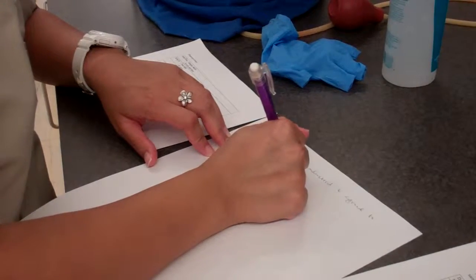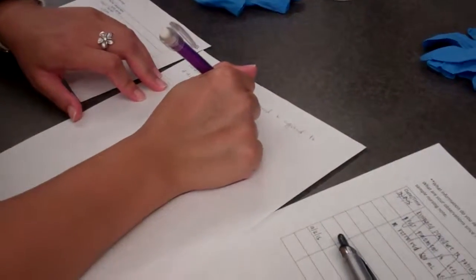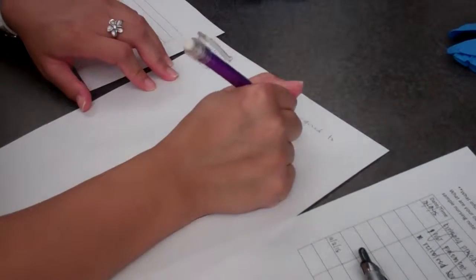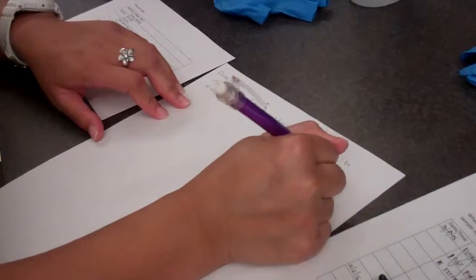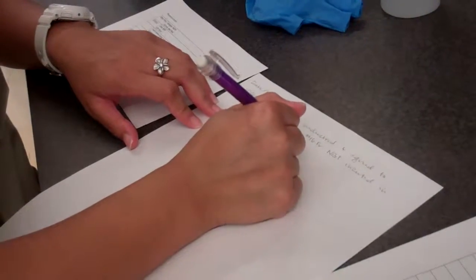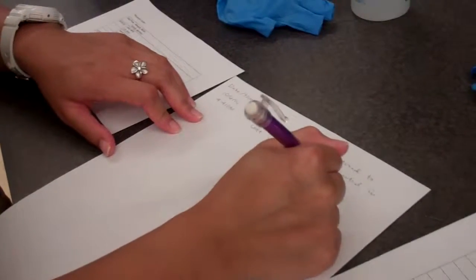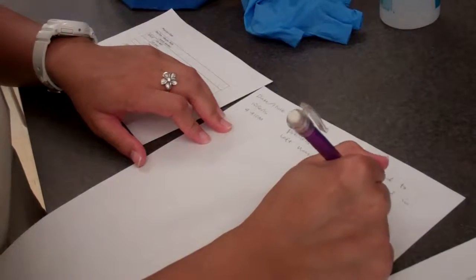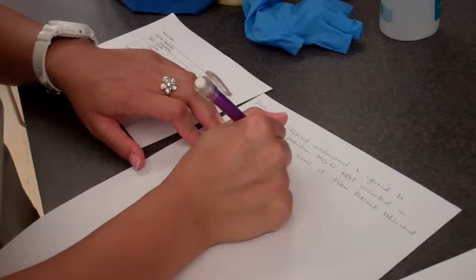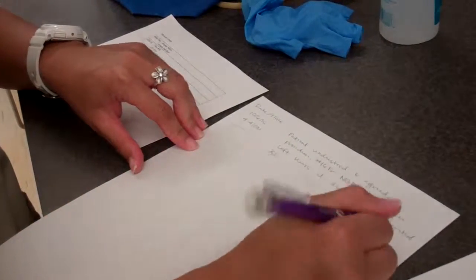Procedure. Number 16 French NG tube inserted, left nare, at 35 centimeters, patient tolerated. And I would initial, and I'm going to cross out to make sure there's no other person assigned.